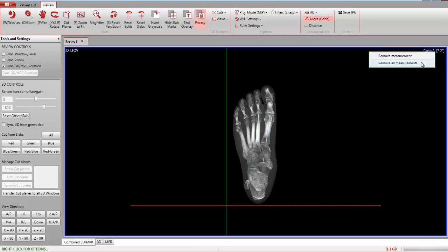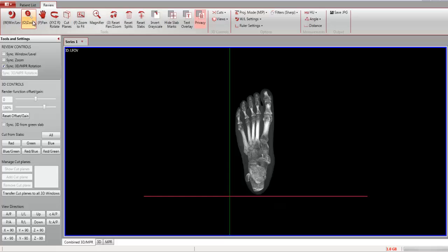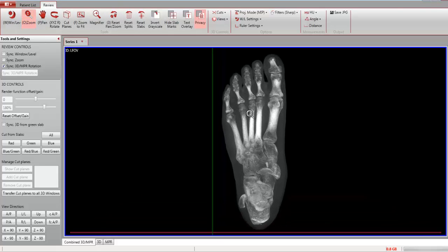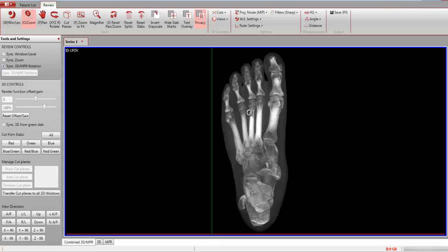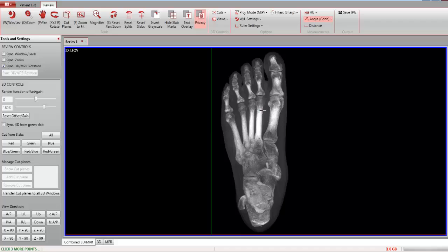An alternate method of measuring the inner metatarsal angle is to make two sets of Cobb angle measurements and correlate them. Select Zoom to enlarge the image for easier selection of your starting point. Click Angle and select Cobb.